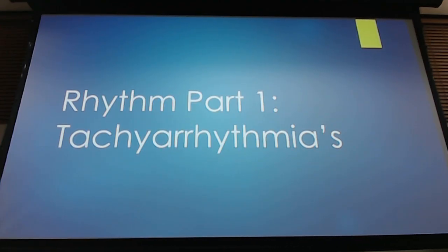So how I want you to approach this is you're looking at an ECG. And on that ECG, you look at that bottom 10-second rhythm strip. When you look at that 10-second rhythm strip, you say, let me see what this rate is. And the rate is greater than what? 100. The rate is greater than 100. These are the differentials that I want you to put in your mind when the rate is greater than 100.